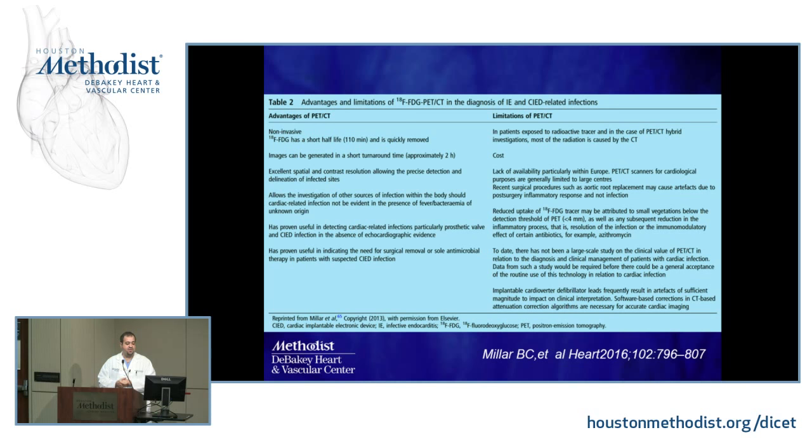Some of the limitations of PET CT: it is not widely available. And practically, some small vegetations may not cause a high FDG uptake. So you also have to bear in mind that the spatial resolution is not super high, so anything less than 4 millimeters may or may not be taken up by FDG. And we're still waiting for large-scale studies to look at the clinical value of it in patients with cardiac infections.